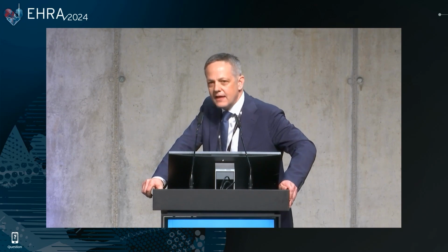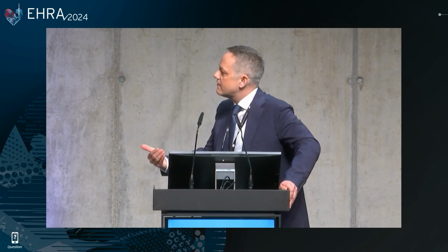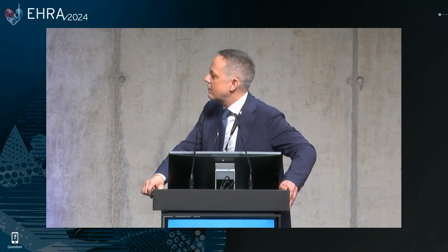And number three, I see, of course, the new tools on the horizon, 3D mapping integration that I've shown. And the hope is that with these tools, we will solve the problem of PV reconnection, or at least decrease it to a minimum amount.